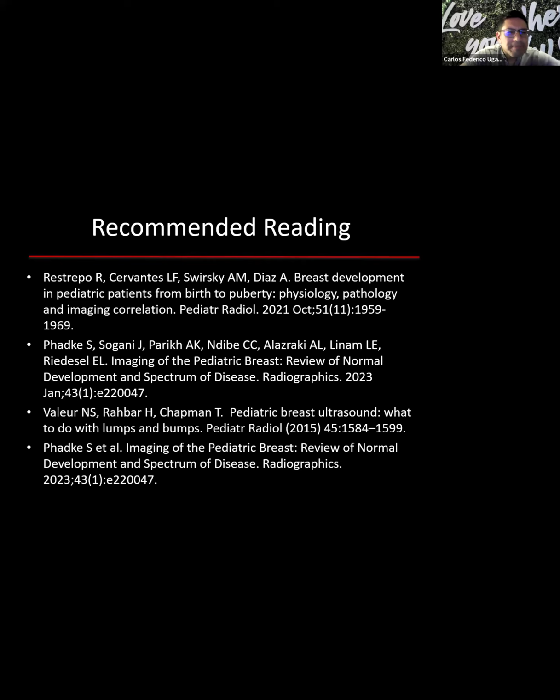Well, we have another question. Are there some differential diagnoses in a male patient with a subareolar cyst? In a male patient, really no. I mean, I shouldn't say no. Very rarely breast cancer happens in men. I have never seen one or heard of one in an adolescent boy, but theoretically it could. So if you see something with very ugly, concerning features, then you could consider any of the same breast lesions that we see in girls, including invasive breast cancer. But subareolar tissue in the boy, if it looks like normal glandular breast tissue, that's gynecomastia. Yeah. That is a very nice tip, I think.